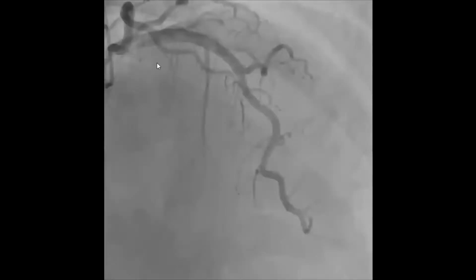Because it's a cranial view, the vessel that is most visible on the cranial view is the LAD. And this is an RAO cranial view. What you're seeing here is the LAD. And again, this is your diagonal. Diagonals are always going this way, and septal perforators are going the other way. So several septal perforators, several diagonal branches. This vessel here, the LAD, reaches the cardiac apex, and it goes a little bit underneath the apex as well.